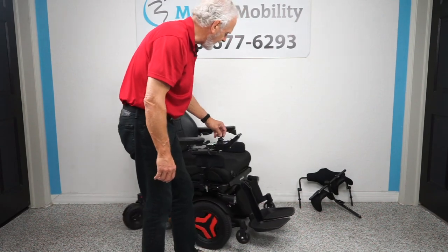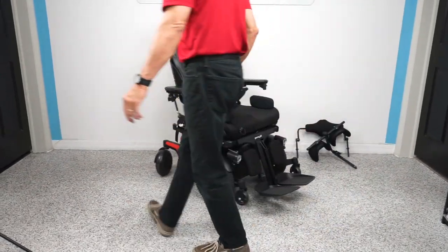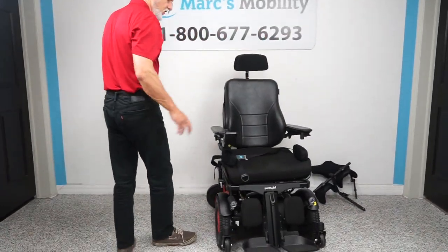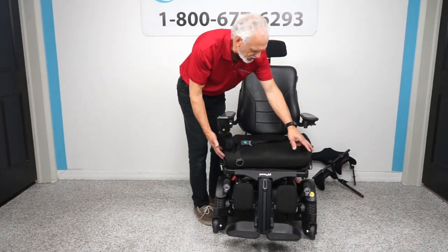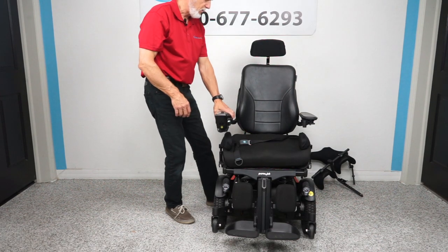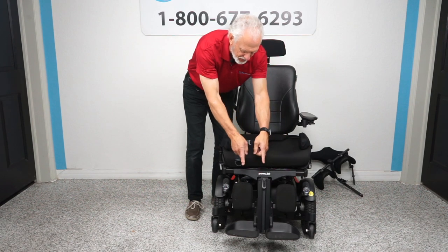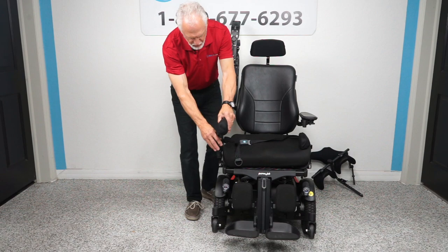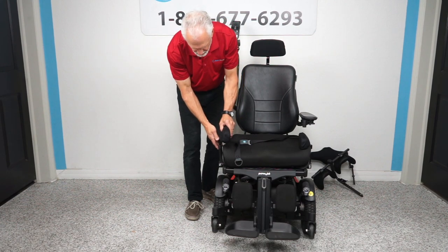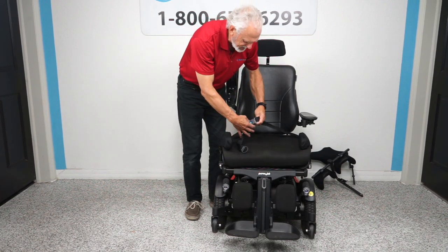It's a front-wheel drive, so here's what the turning radius looks like in your house. The seat right now is set up for a large person — 21 by 21 inches — but we can make it as small as 16 inches. The arms flip up. You also have lateral knee pads, which keep your knees together and your feet on the foot plate. These lateral pads are removable and fully adjustable — they move up and down the shaft, and in and out. They're great for keeping feet on the foot plate.